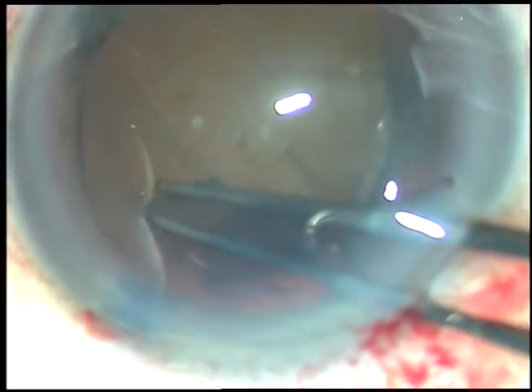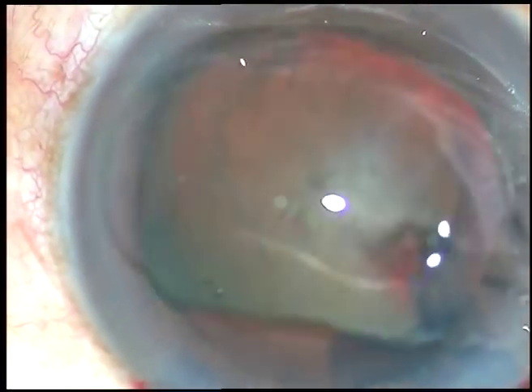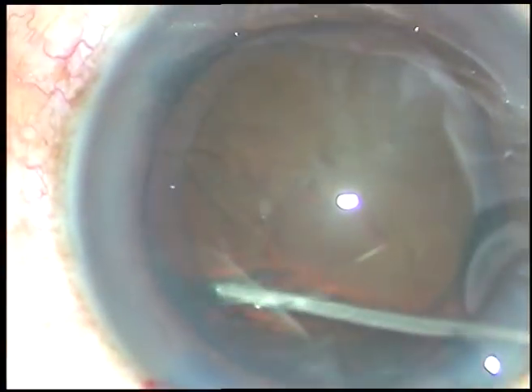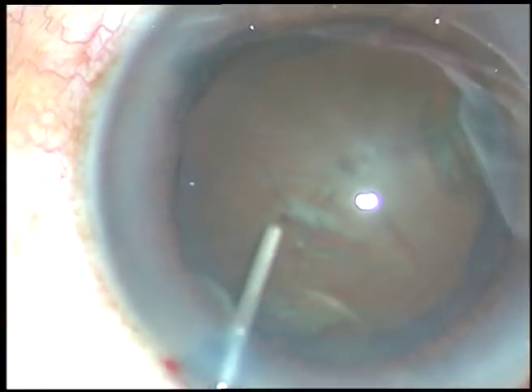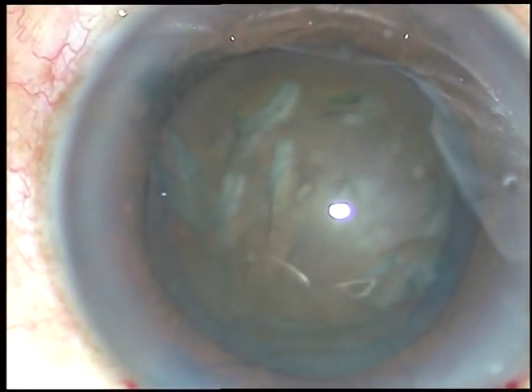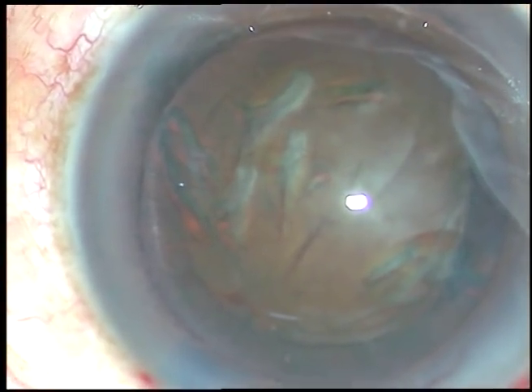In hard cataracts, I aim for at least a 5.5 mm rhexis or 6 mm. Nucleus management will become very predictable if you make a large rhexis. Don't worry about the optic of the IOL being overlapped by the anterior capsular rim, because the capsule will contract — the rhexis will contract to some extent — and it will overlap the IOL in the coming few months.